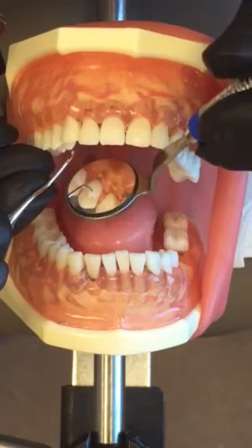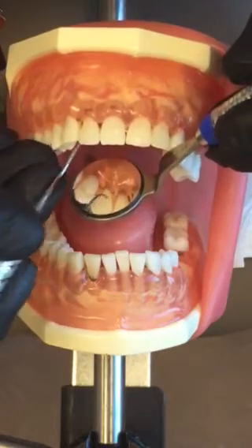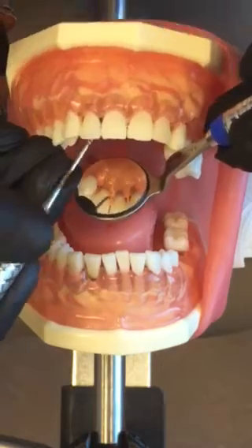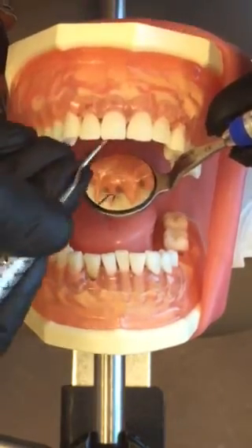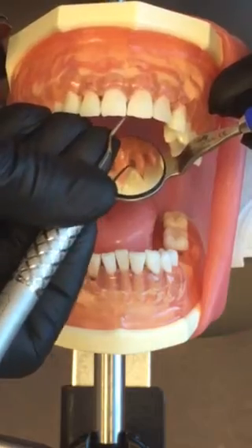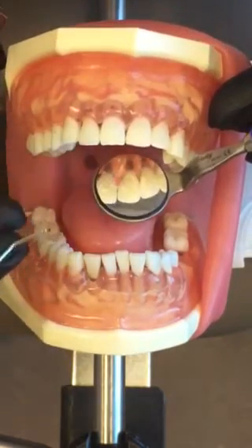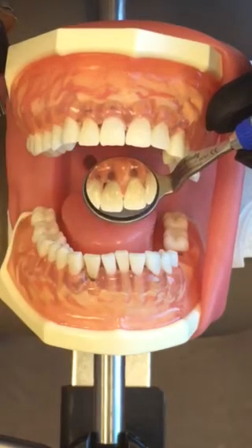So I'm going to use indirect vision with my mirror, canine to canine — midline and roll, midline and roll. This works the same on the mandibular teeth. So this is your Anna Paterson Gracie 1-2 area specific curette used for anteriors only: one end for surfaces towards, one end for surfaces away.